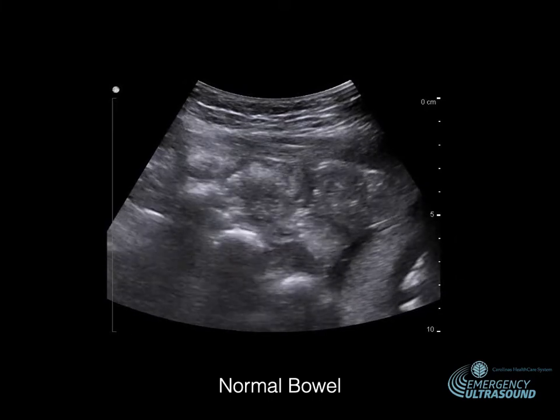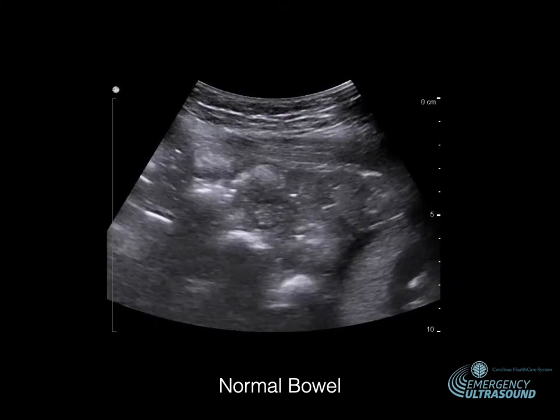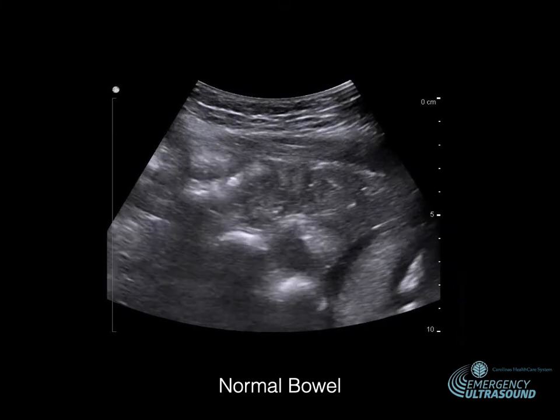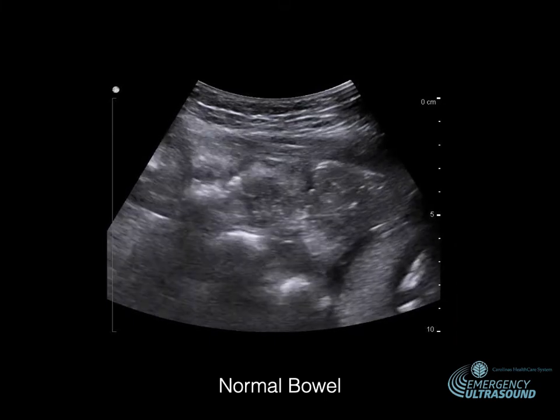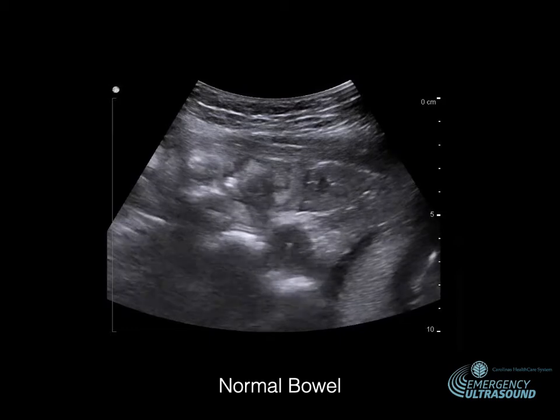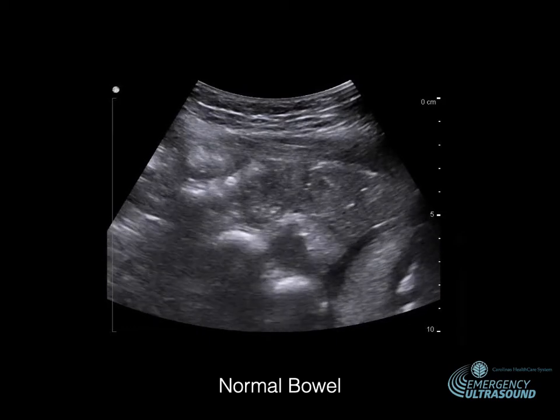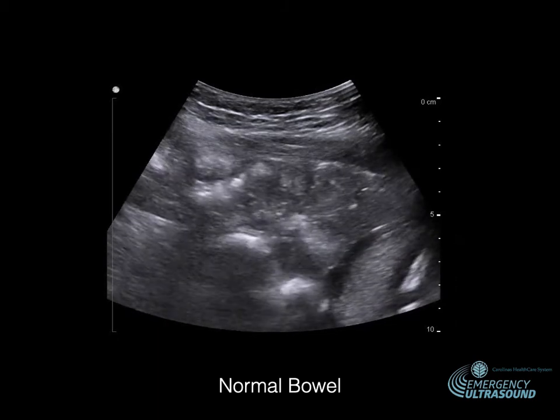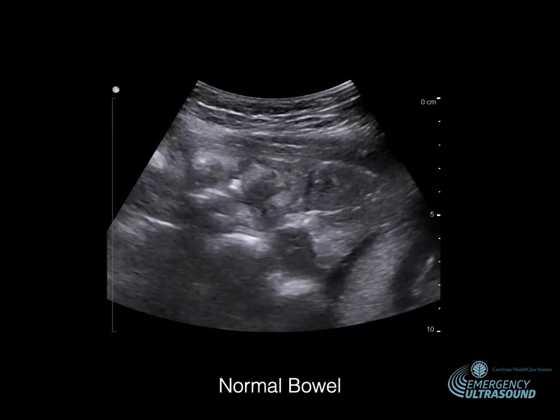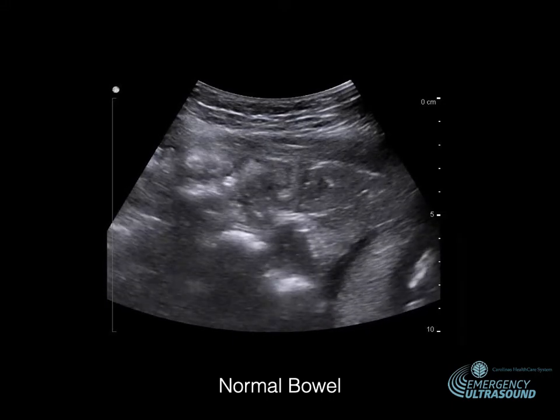But first I'm looking, and we're seeing some normal bowel right here. If you look around the mid to right side of the screen, we're seeing bowel lumen. We are seeing just nice peristalsis. That bowel is just peristalsing and moving and pushing that content onward, and that's very unexciting, that's normal bowel. So nothing really exciting to see here. That's just normal bowel. Kind of looks like just gray waves smushing around in the middle of the screen.